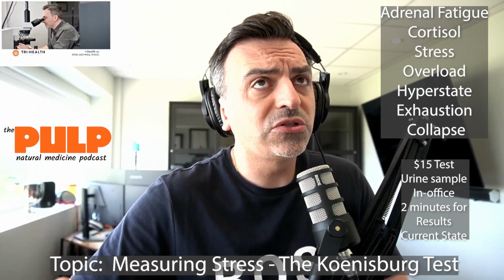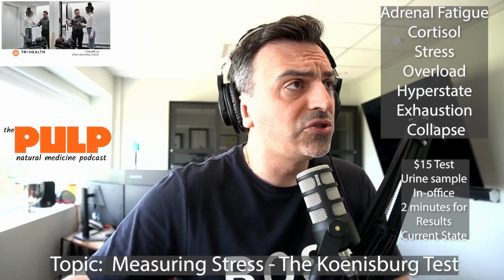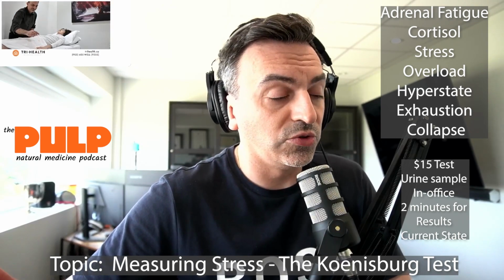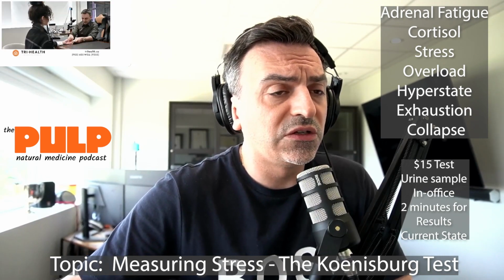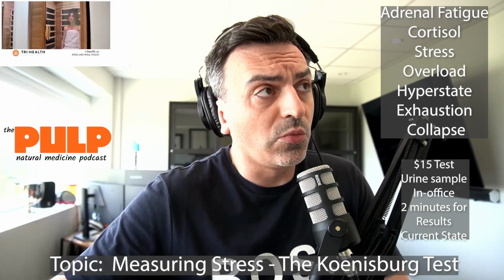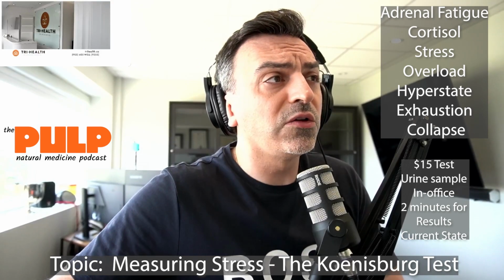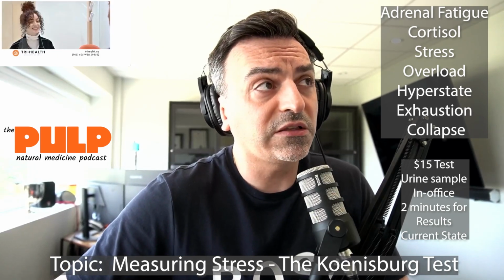The normal range is about 17 to 25 drops of the reagent. If you have a color change in that range, it's considered normal stress hormone function or output. If it takes less than 17, between 1 and 16 drops of the reagent to make a color change, you're considered in a hyperadrenal state, meaning your body's producing higher than average adrenal stress hormones, which is normal for short periods of time. You want your body to increase its output of stress hormones, because if you have a stressful day, you're working hard, you're very busy, your body will feel that it has a higher demand on its stress resources, and therefore you have to produce more. And that's fine in the short term.